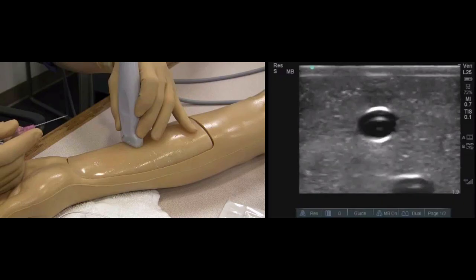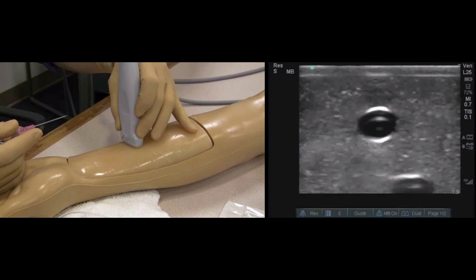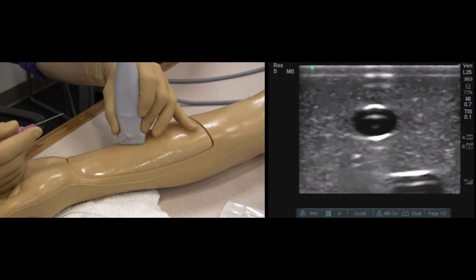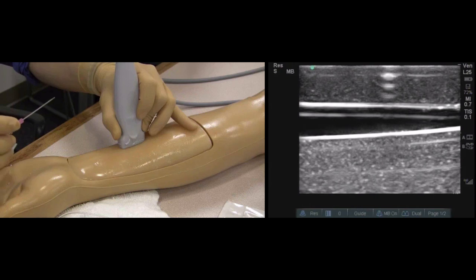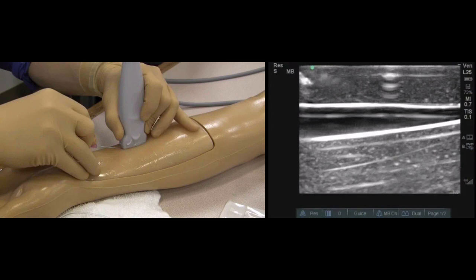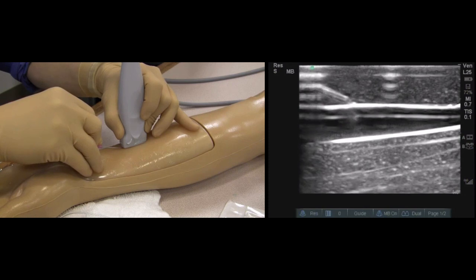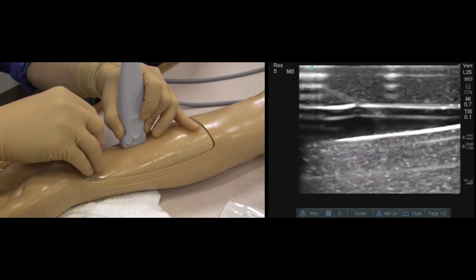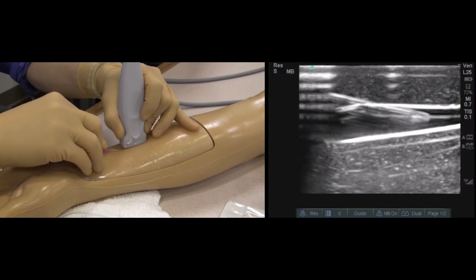Here we're accessing a forearm vein on a phantom as a demonstration. With a low grip on the probe and the hand braced, the arm is positioned so we're accessing in the direction of vessel travel. We rotate from the transverse view to a sagittal view with nice bright walls confirming we're in the center. We align the needle with the center of the probe, insert, and once the needle tip is visible, we direct it to the anterior wall of the vessel, puncture the anterior wall, enter the lumen, confirm the tip is within the vessel, and thread the catheter.